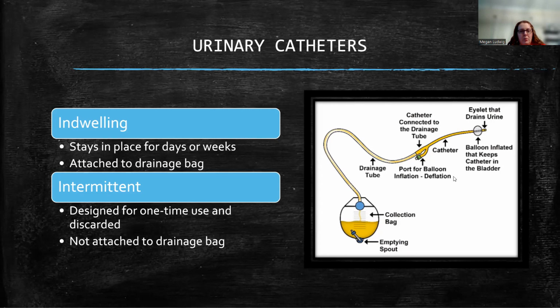So look at the parts here of this indwelling catheter. This often comes in like a whole kit. You have a whole Foley prep kit that comes with some sort of prep solution, whether it's betadine, whatever, sterile gloves to help put it in.